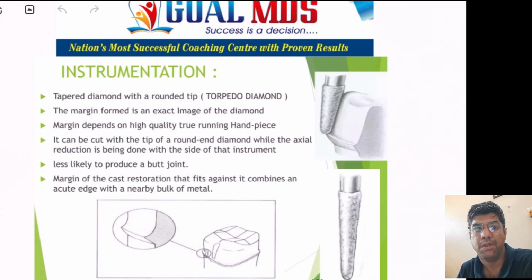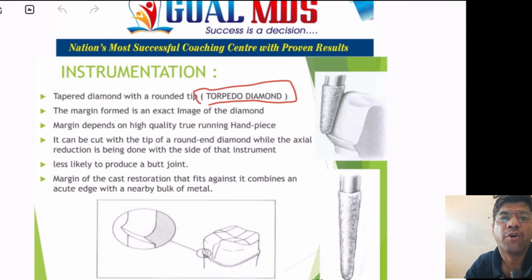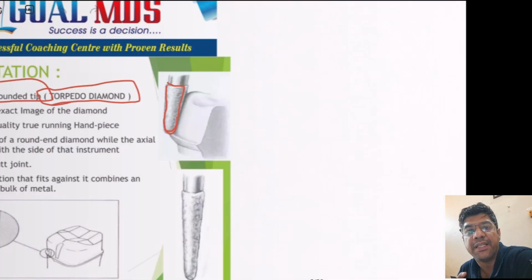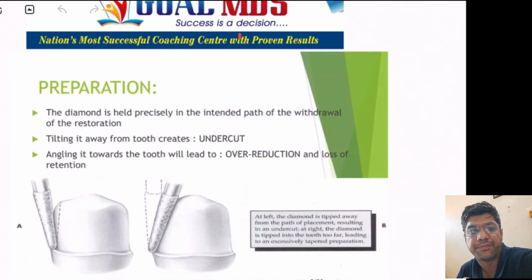Now, what are the tools for preparation? We use a torpedo diamond bur. Which bur? Torpedo diamond bur, that is a tapered diamond with a round tip. The bur is used to create this type of finish line.